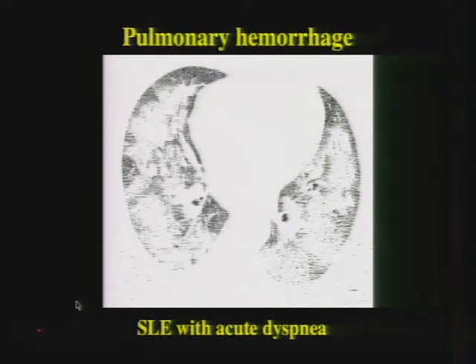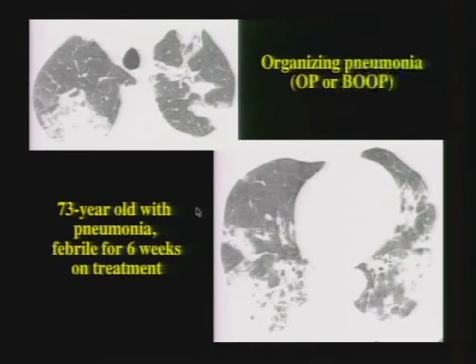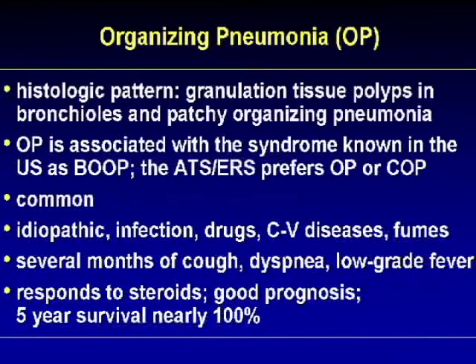Here is a patient with lupus and acute dyspnea showing patchy consolidation — consolidation with acute symptoms. Here is a 73-year-old treated for pneumonia who remains febrile after six weeks — chronic symptoms with patchy areas of consolidation, some peripheral, some central and peribronchial. This is a great appearance for organizing pneumonia or BOOP. Organizing pneumonia is characterized by granulation tissue polyps in bronchioles and patchy organizing pneumonia; it was formerly called bronchiolitis obliterans organizing pneumonia, but the organizing pneumonia component is now emphasized and preferred as the name.